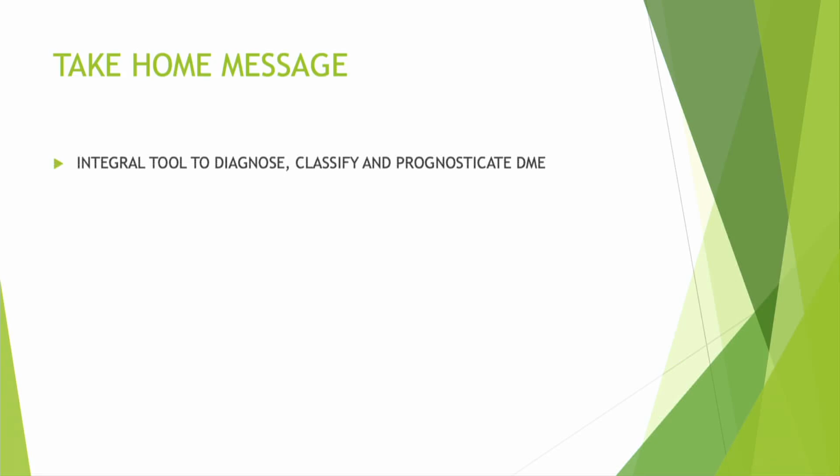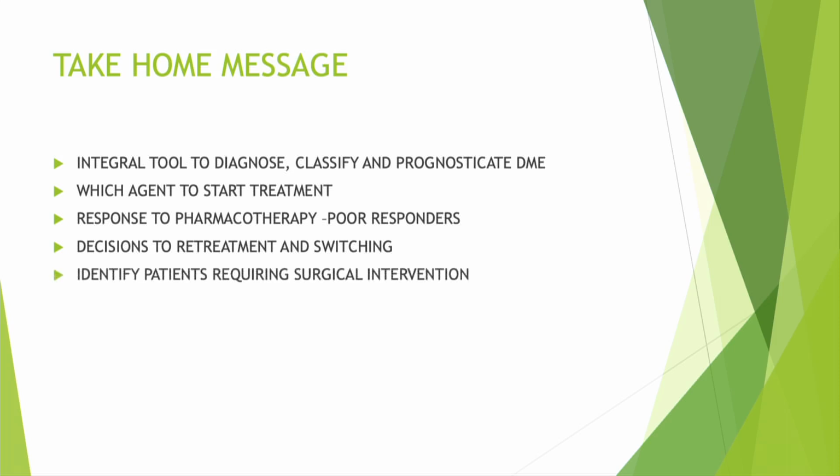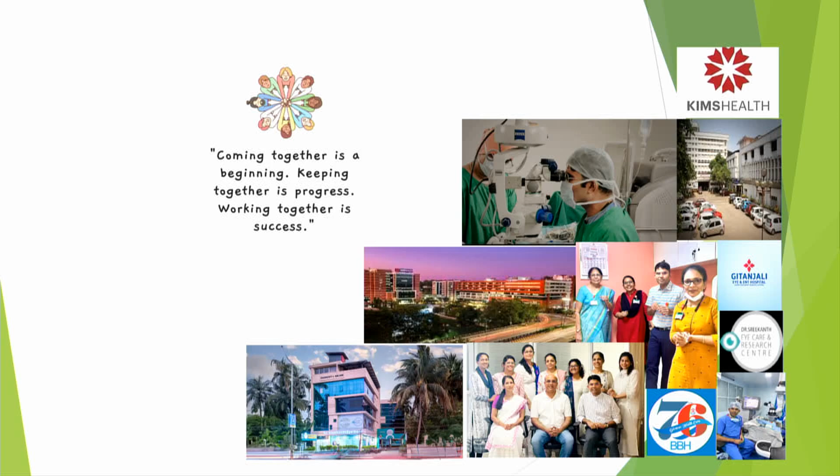So OCT is an integral tool to diagnose, classify and to prognosticate DME and identify which agent to start your treatment, assess your response to therapy and identify the poor responders, and also to take decisions on retreatment and switching between agents. And it also helps to identify patients who need a surgical intervention. And OCTA has got a promising role by identifying disease in the preclinical stages and also identifying poor responders. Thank you.